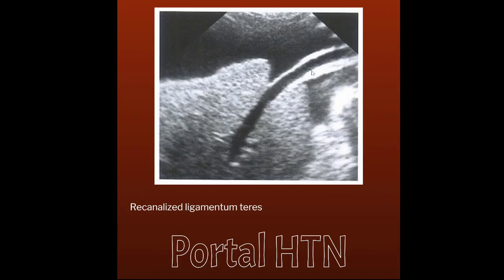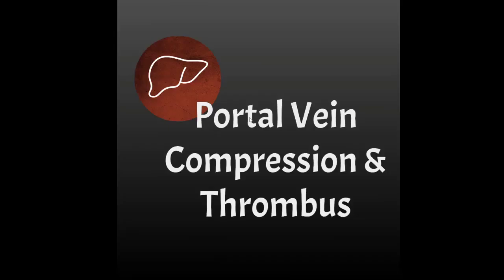If a patient has this recanalized ligamentum teres, definitely take eyes down to the belly button, see if there is that caput medusa. Take some images of that area if you see it. In this picture, though, we can see that scalloped edge, very increased echogenicity of the liver, ascites surrounding as well. So all hallmark signs of cirrhosis, which leads to portal hypertension.